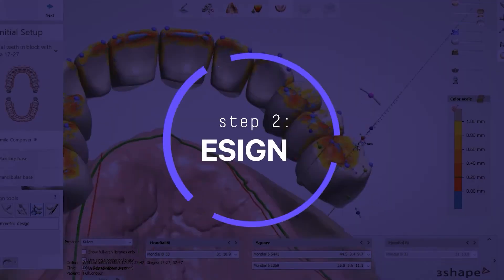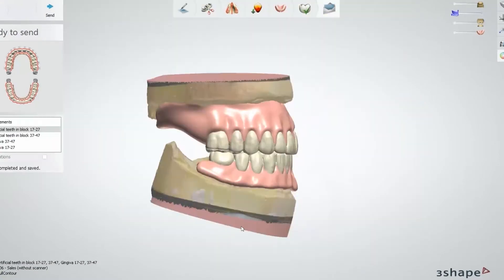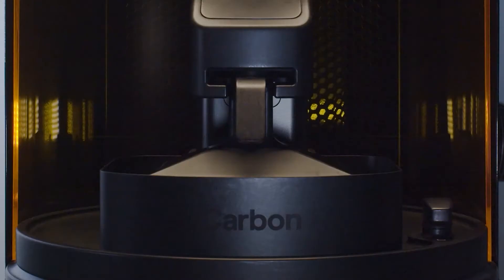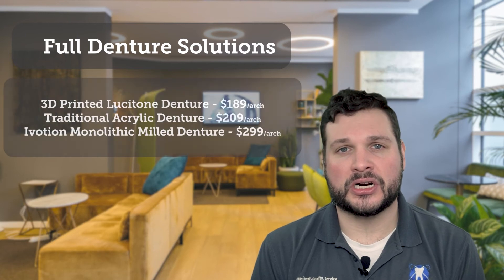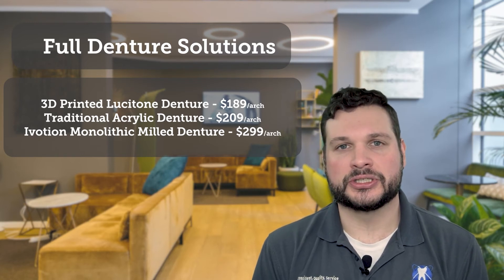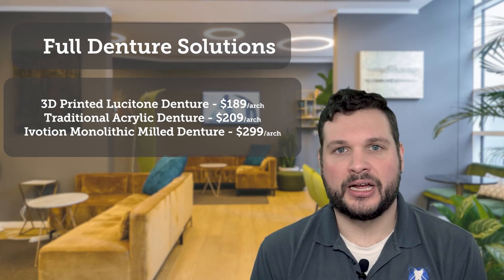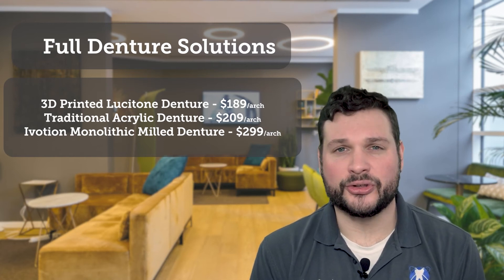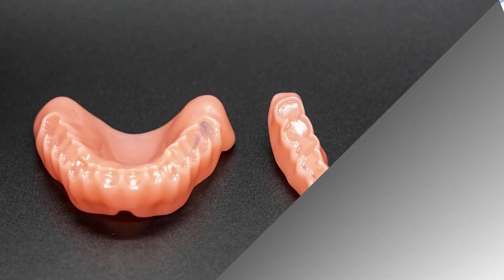The biggest advantage is in the design process — it's really an in-lab advantage more than anything. The process is less laborious and takes less time, allowing our lab techs to focus on more demanding cases, and we pass those savings on to you. We have three different full denture solutions, and the 3D printed digital dentures are the most favorably priced. We hope to transition the majority of our clients to digital dentures within the next couple of years, and expect digital dentures to far outweigh traditional dentures in terms of volume within two to three years. Another added benefit is record storage — we keep a digital file of all cases.